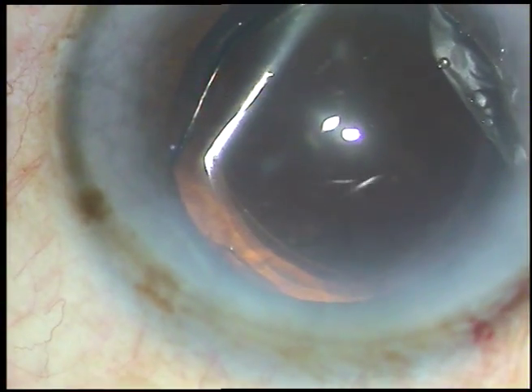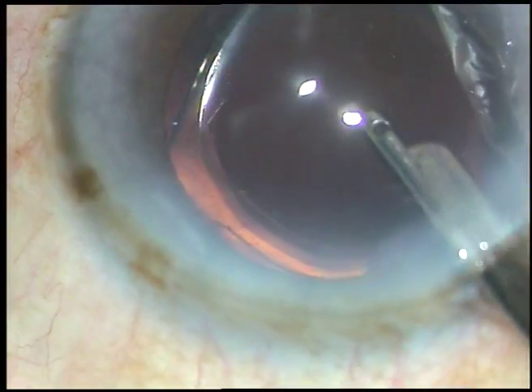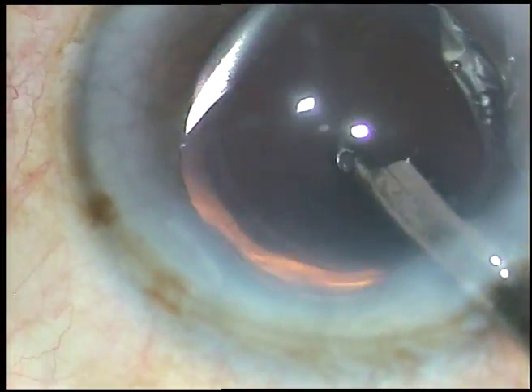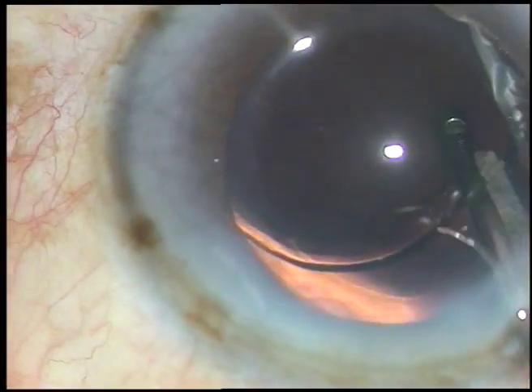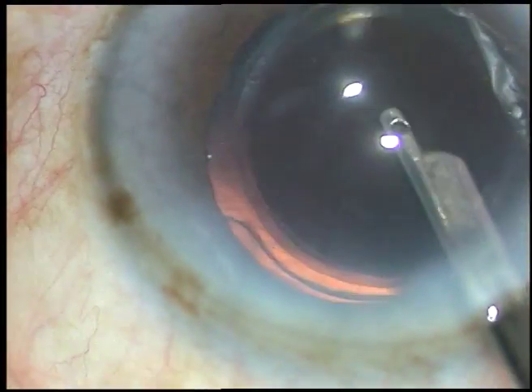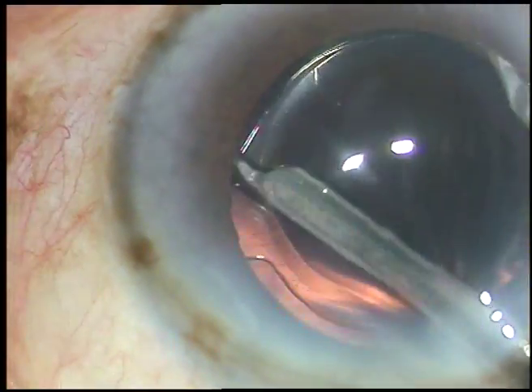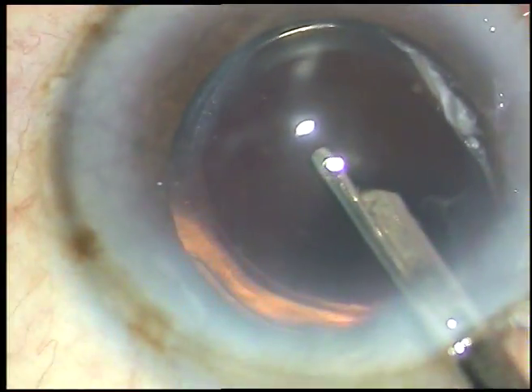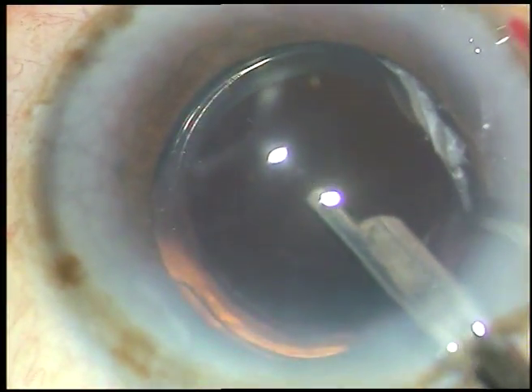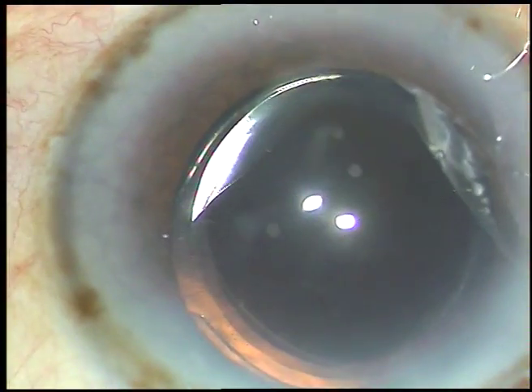The most important thing is that at the conclusion of surgery, all the wounds should be nicely sealed. There should not be any wound leak from any site. We should not depend on air — we should not inject air and just leave it like that. All the wounds should be watertight. This is the final lavage. The anterior chamber is formed and the case is concluded.